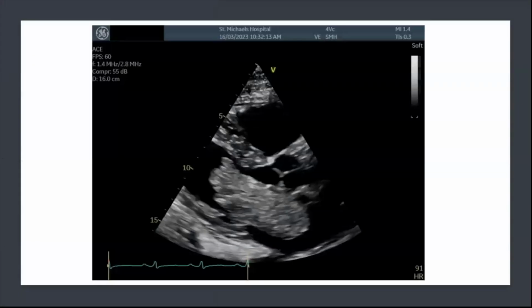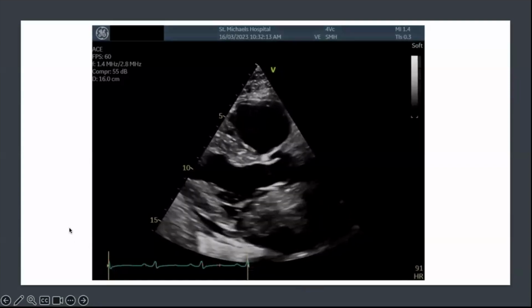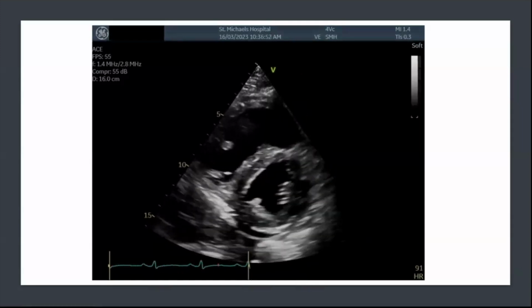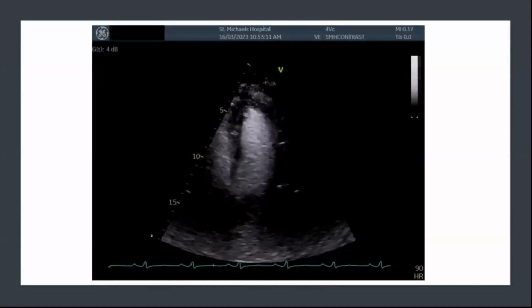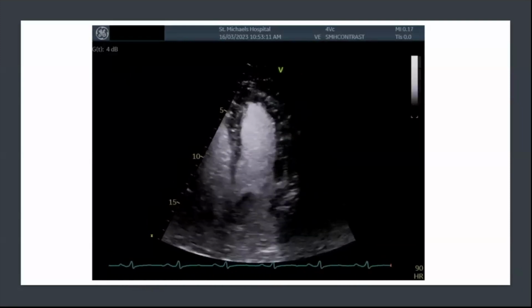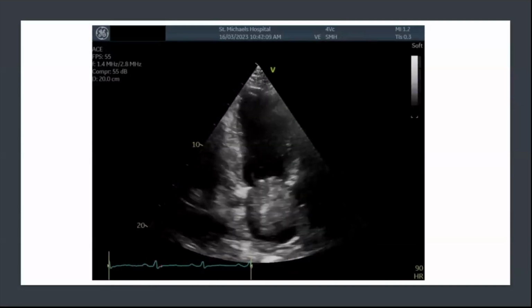Here's an example of a cardiac myxoma that was taken at St. Mike's. What you can see here is something that shouldn't be there, traversing the interatrial septum, and it's very nice to see in the short axis that it's going from the atrium to the ventricle. I just showed the contrast images here to show that they're usually avascular, so they won't contrast enhance.